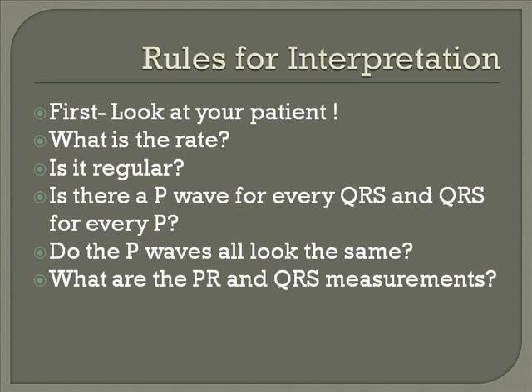Now, there are a lot of rhythms. There's somewhere between 30 and 40 of them that we will identify in this lesson. And there are a lot of rules to remember. So don't expect you're going to remember them all right away. Give yourself plenty of time to remember these. It will take you days to weeks to remember them, and it will take you months in actual practice to actually feel comfortable identifying them on the monitor without having to print it out and do all the full measurements. So give yourself time and excuse yourself when you make mistakes on them. That's expected and an important part of the learning process.